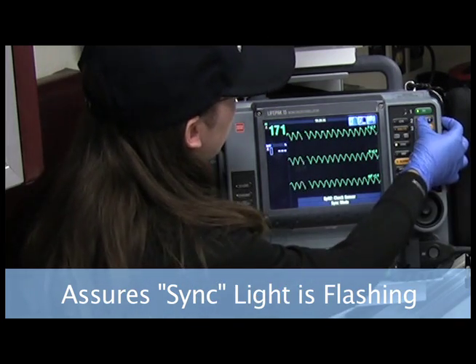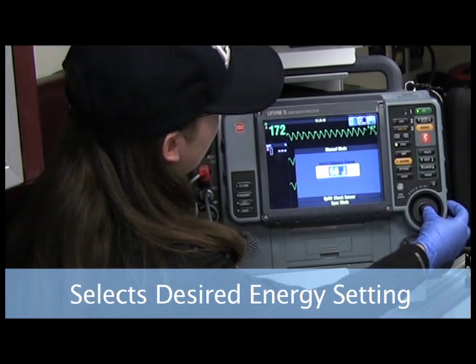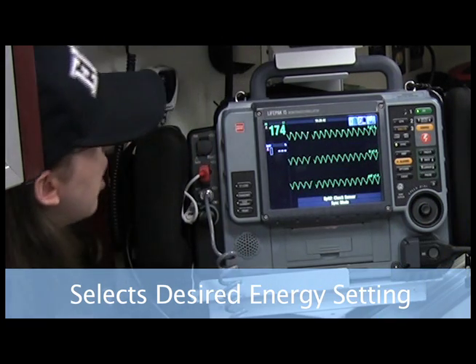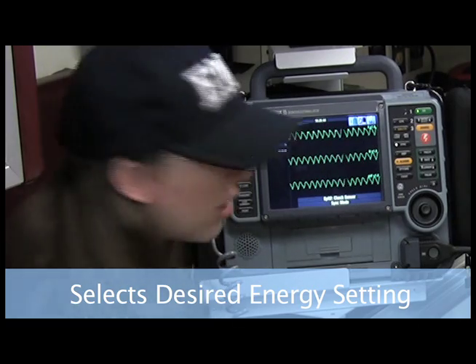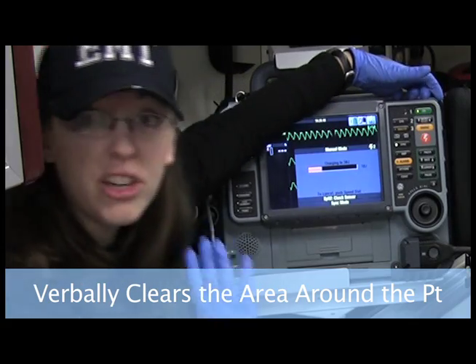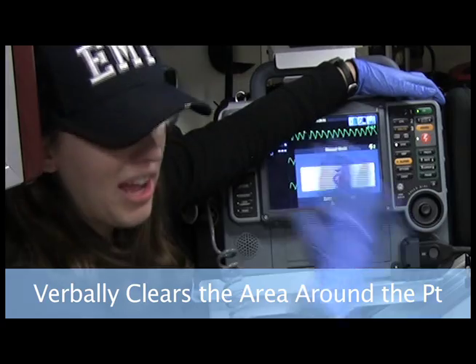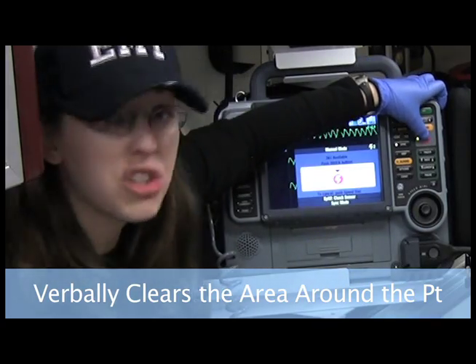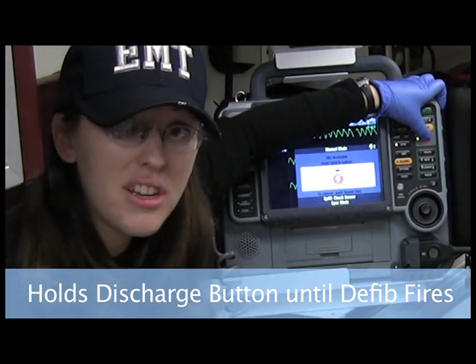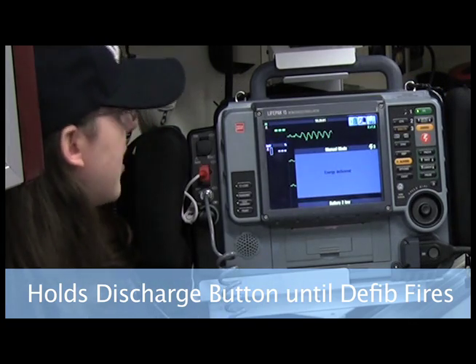I also want to choose my energy. They want me to shock at 50 joules for the first shock. So it looks like I'm ready to go. I'm going to hit charge. Make sure everyone is clear of the patient — are you clear? I'm clear. Everyone clear of the patient. Shocking. I'm holding down the button until I hear that click, so that I know energy has been delivered.